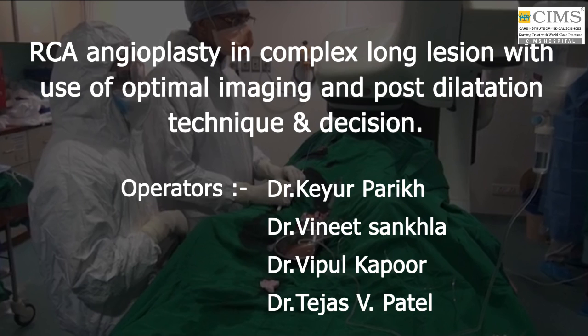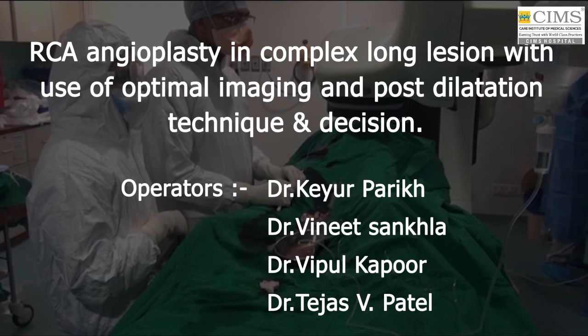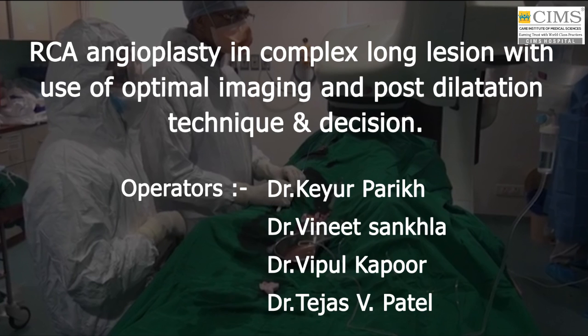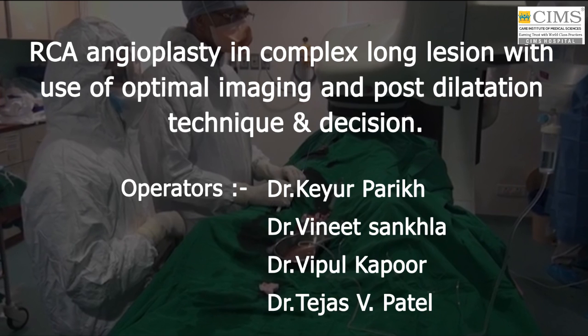Today we'll be showing a live demonstration of a right coronary angioplasty in a very complex long lesion, with the background of use of optimal imaging as well as optimal post-dilatation technique and decision making. I have with me Dr. Vineet Sankhla, Dr. Vipul Kapoor and Dr. Tejas V. Patel. All are partners and associate cardiologists at CIMS Hospital, Ahmedabad.